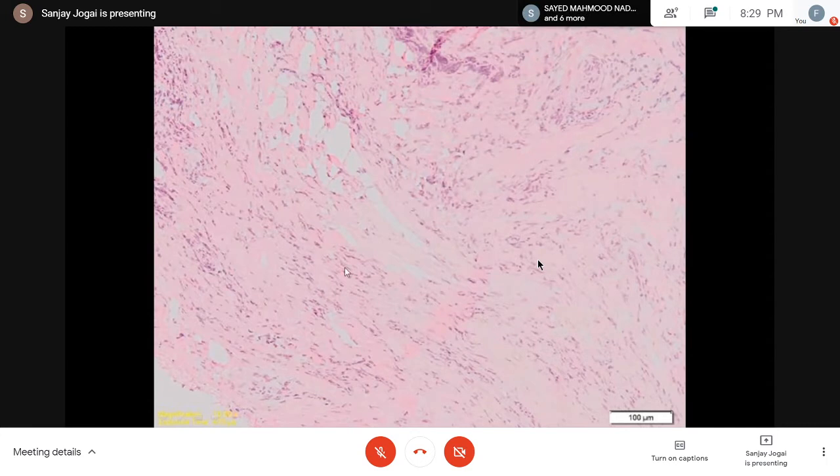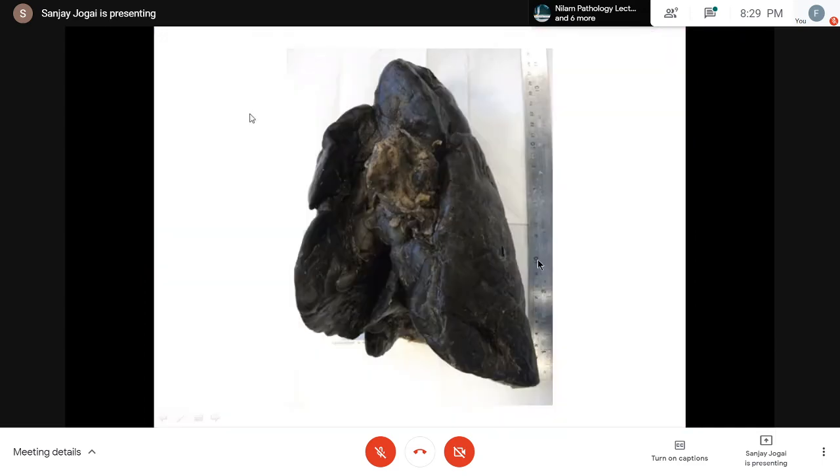I really struggled. I said, okay, you are saying this is a pulmonary artery sarcoma. The cells look spindly, they are very crushed, I can't see much atypia, and I said I'm not sure what is going on here and I'll have to defer it to paraffin, but what would you do? The surgeon said the lung is anyway gone, which I'm sending you in a bucket, so we are going for a pneumonectomy. And you can see in the following pictures that the lung indeed was gone.